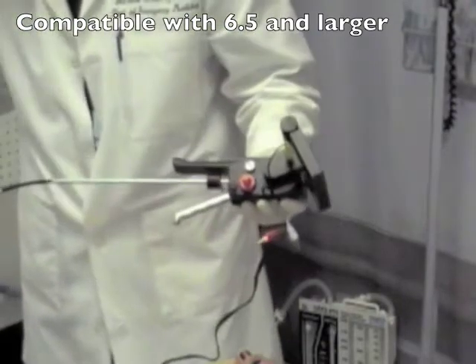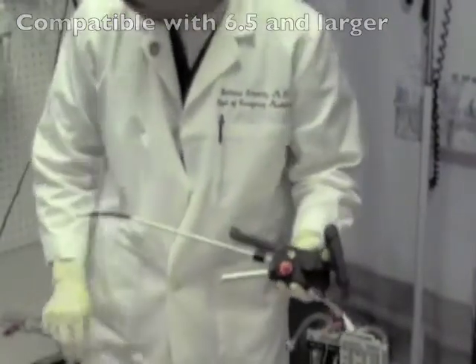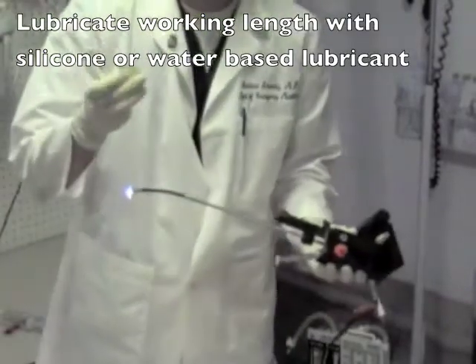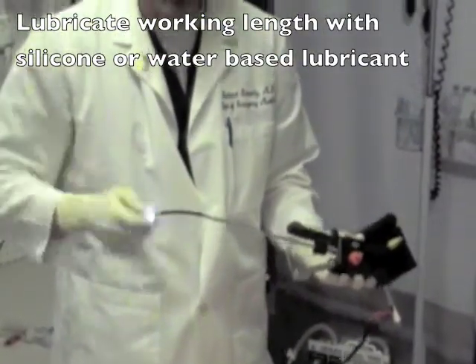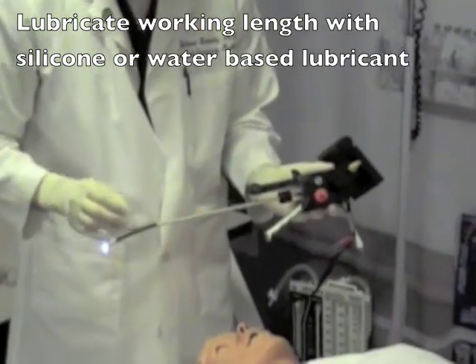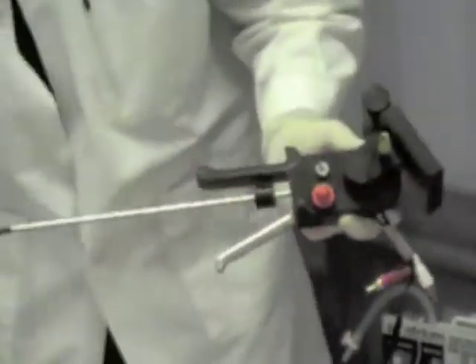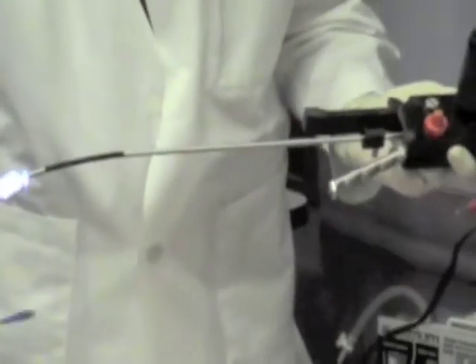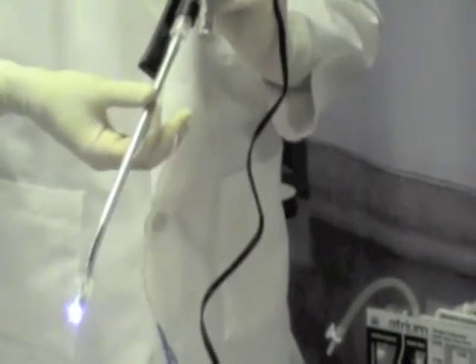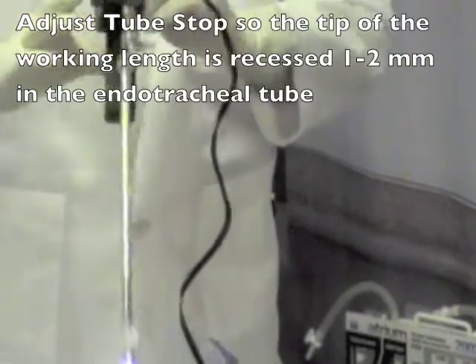To intubate using the Video Rifle, you first take an appropriate sized endotracheal tube. You will need to lubricate the stylet using either a silicone based or water based lubricant. Simply apply a few drops of the lubricant on the working length. Insert the endotracheal tube and make sure that it is well lubricated. Gently seat the endotracheal tube into the tube stop.